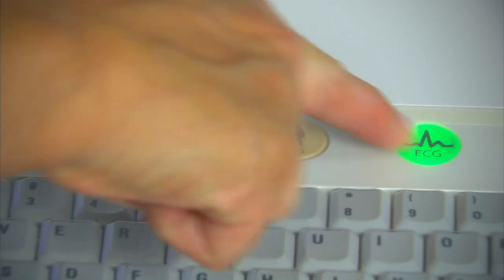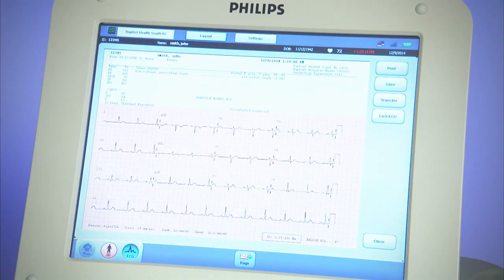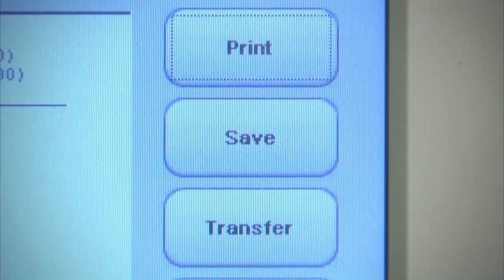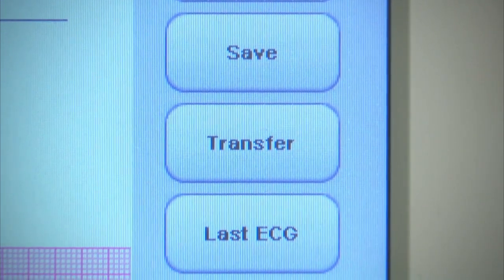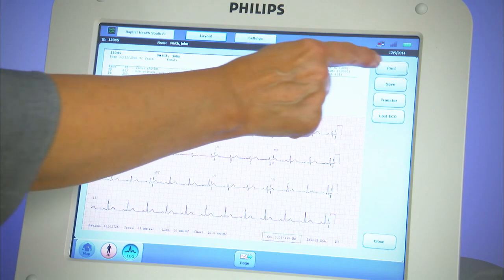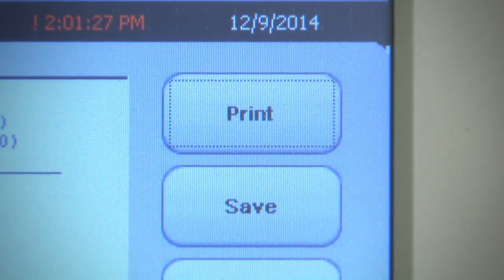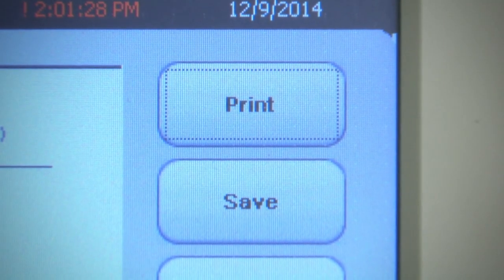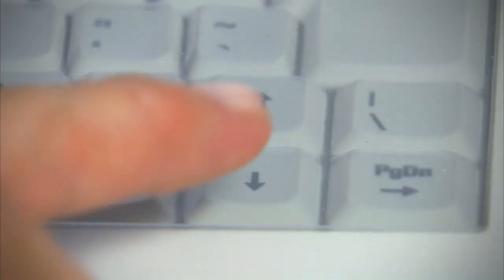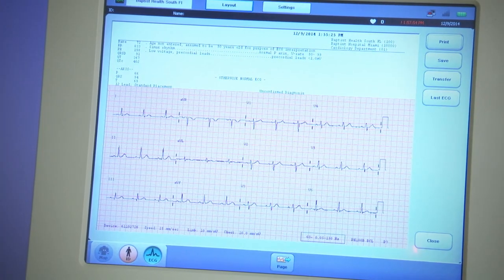The completed ECG with analysis report appears within seconds. The four operations near the upper right of the ECG may be performed independently or linked together for ease of use and to ensure that all four are performed. Print the ECG on the cardiograph recorder. Save the ECG in the memory of the PageWriter TC. Using the down arrow on the PageWriter, a different view of the ECG may be seen and printed if desired.